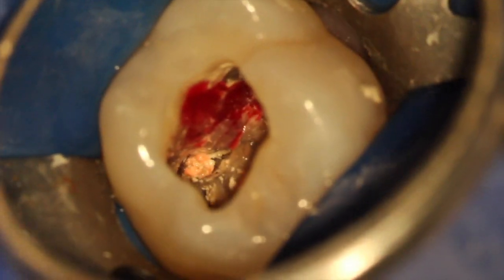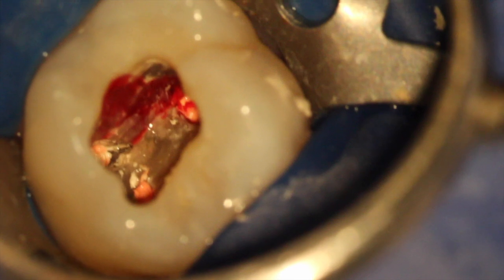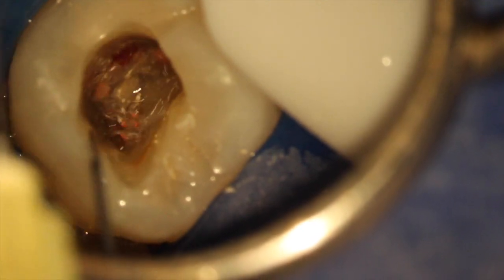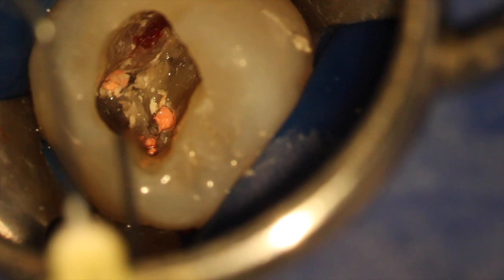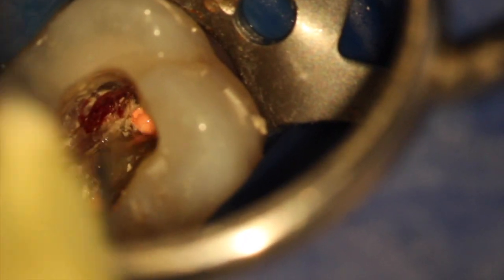Root canal treatment was performed, although in ECIR cases the pulp is vital but there is communication, so we start with the root canal treatment. Multiple rinses were done, especially citric acid rinse.